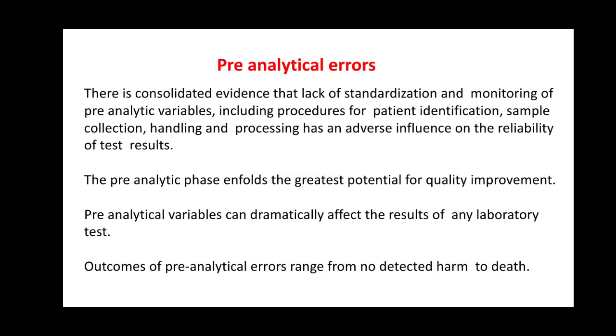So the next topic we'll see is pre-analytical errors. As we do the processes in a laboratory, such as specimen collection, we come across some errors, defined as the discrepancy between the results obtained in the testing process and the true or accepted value. There are three types: pre-analytical, analytical and post-analytical errors. We'll see the pre-analytical errors here.